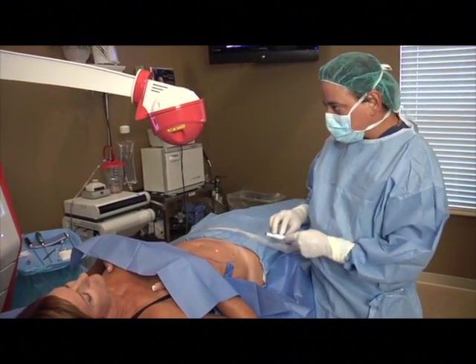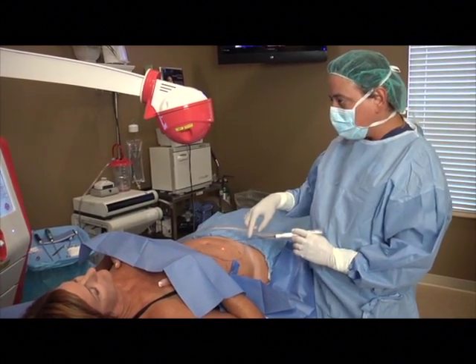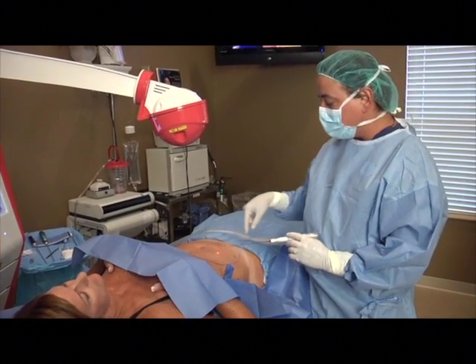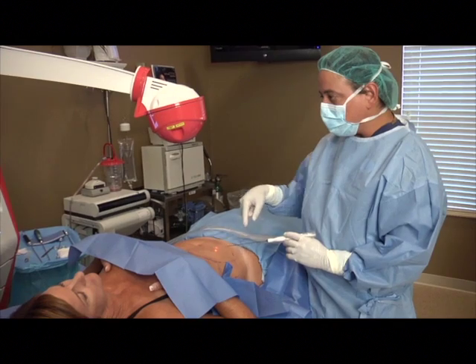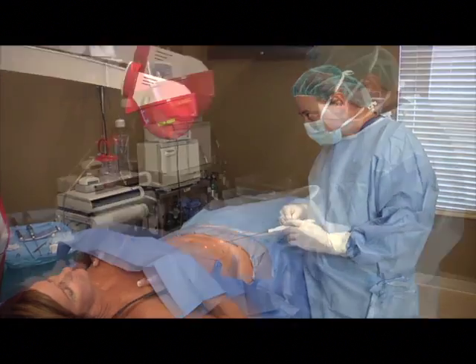And the screen, we're getting ready to calibrate the laser, and we're going to make a circle on her abdomen where we're going to be doing the lasering. So we're mapping out the data for the GPS system right now.